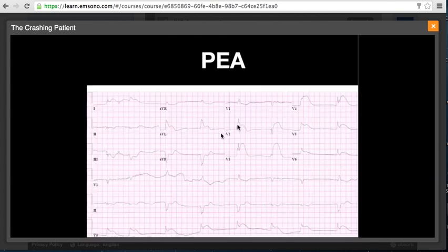Once we were able to stabilize the patient, we obtained an EKG that showed that the patient was having a large anterolateral MI. Even though detection of focal wall abnormalities was not a primary goal of our study, in this case it was so obvious that it helped us understand the cause for this patient's PEA arrest and to appropriately treat him in a very expedited fashion.